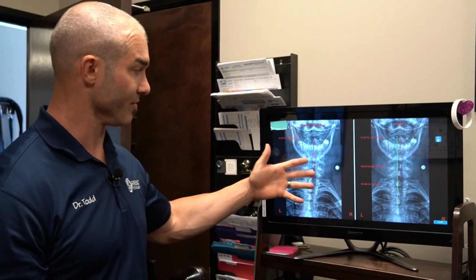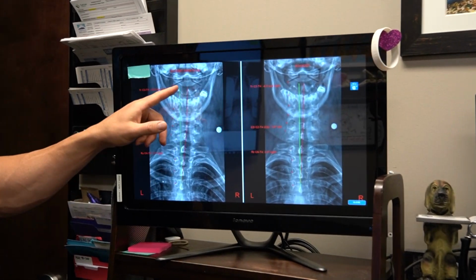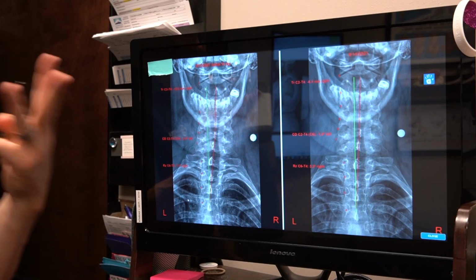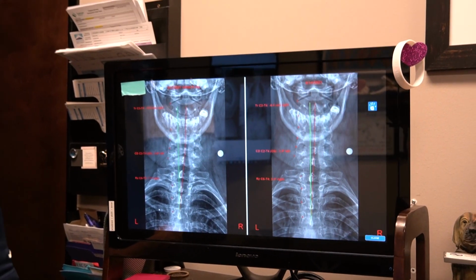All right, so a patient of ours, let's talk about this. This is an x-ray pre and post, 3/11 to 6/14. How far apart is that? About 3 months, about 12 weeks. So it takes about 12 weeks before we can expect to see measurable change on x-ray.